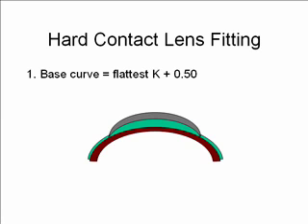You can view a hard contact lens as a device used for holding up the tear film. The hard contact lens also has some power of its own, and that's what we're going to be calculating today. And the hard contact lens also introduces a tear lens. It introduces a gap between its back surface and the front surface of the cornea, and that gap is filled with tears.